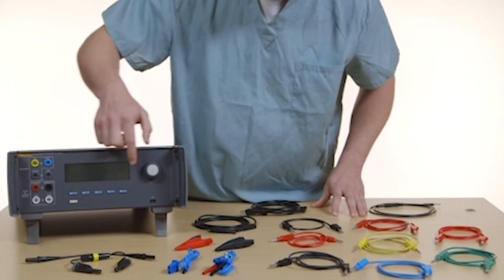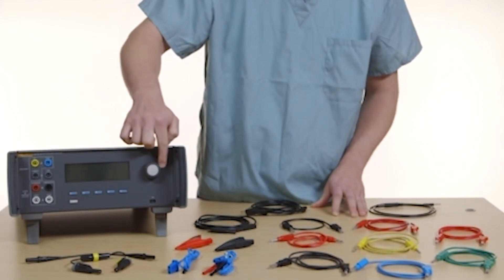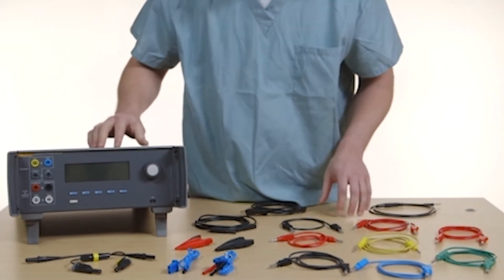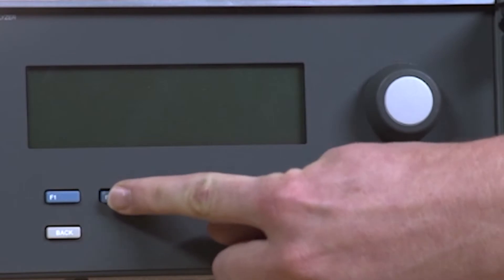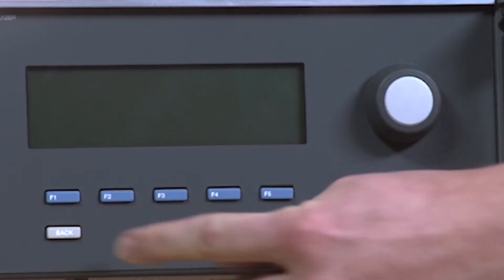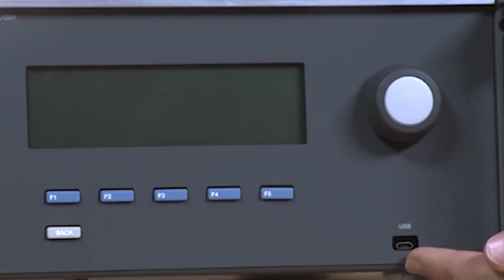The selection knob turns easily to scroll through on-screen instructions and options. The function keys allow you to select testing options. The back button goes to the top or first menu. A USB port, which can be connected to a PC, is also on the front panel.